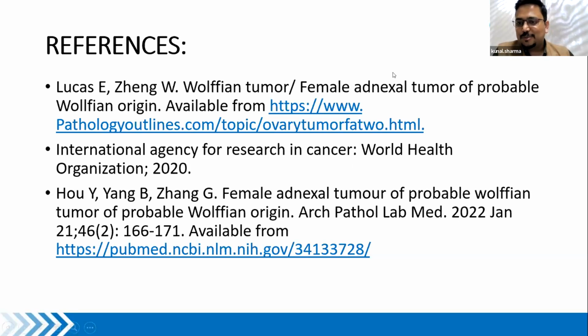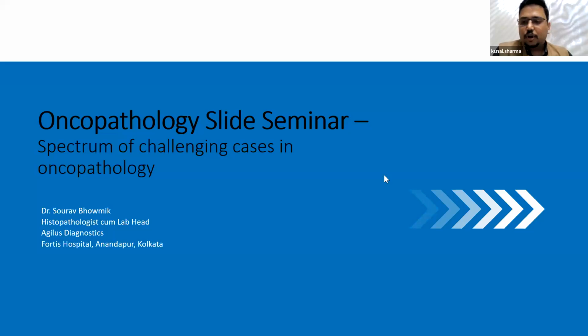This will be from our city of Kolkata. Dr. Saurav will be presenting this case of a 45-year-old male patient, a known case of monoclonal gammopathy, M band present, 0.09 gram per dL. Then IgA kappa has been detected on immunofixation electrophoresis. And what he got was bone marrow biopsy and retroperitoneal lymph node core biopsy for evaluation. Another node and bone marrow, a very, very interesting case. I've seen it. Dr. Saurav, over to you.